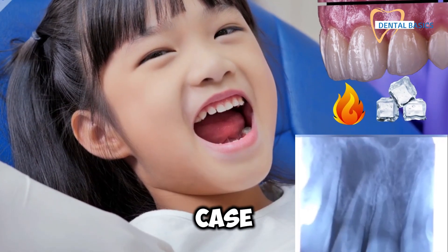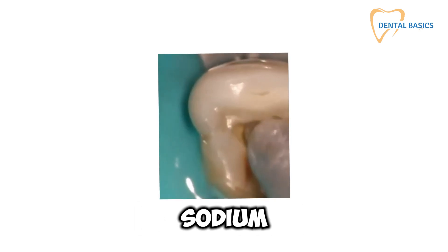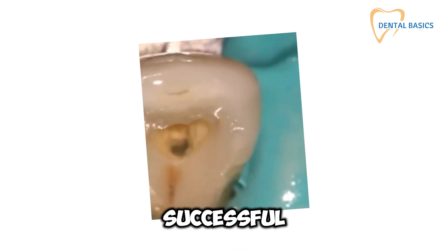Once you've chosen your case, it's all about careful access cavity preparation. Avoid further damage to those delicate root walls, and make sure you're irrigating with sodium hypochlorite to eliminate any necrotic tissue and bacteria. Clean canals lead to successful outcomes.